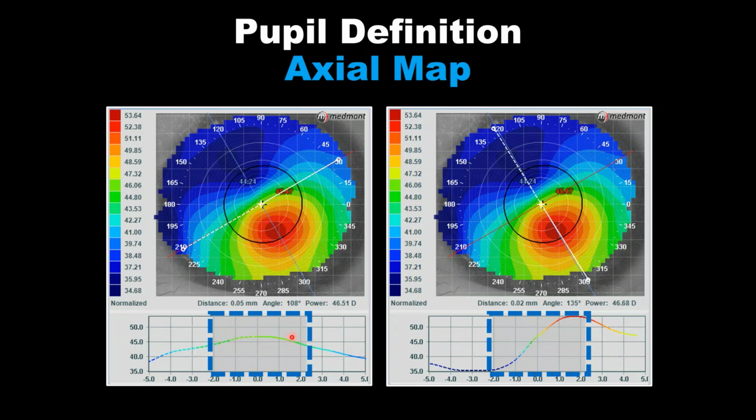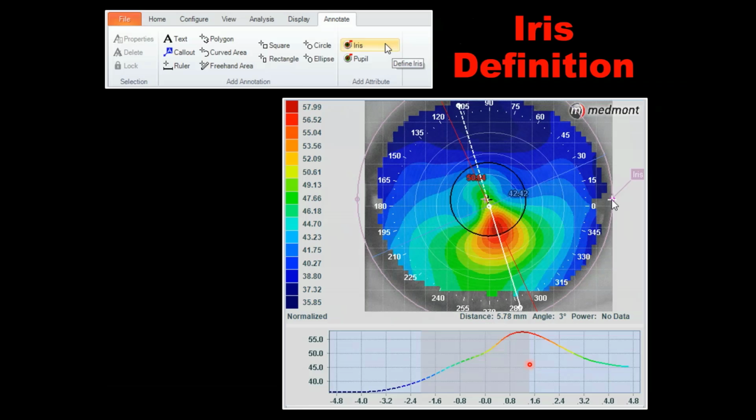Across this meridian of the eye, you notice this keratoconic patient has relatively normal shape. So we would expect, at least across this meridian, the aberrations to be relatively low. However, when we take the axis line across this meridian, across the cone, you notice a massive differential. We go from 53 diopters in the pupil to approximately 34 diopters within the pupil. So that's around a 19 diopter distribution of power within the pupillary borders. So of course, this is a suggestion that this patient may require rigid lens optics to achieve any kind of appreciable quality acuity.